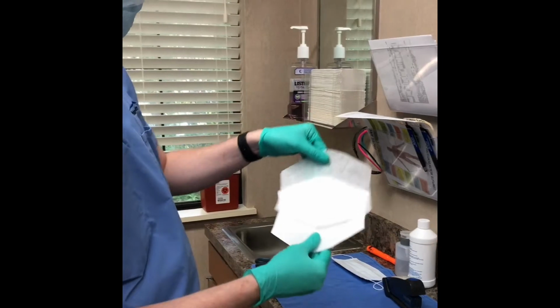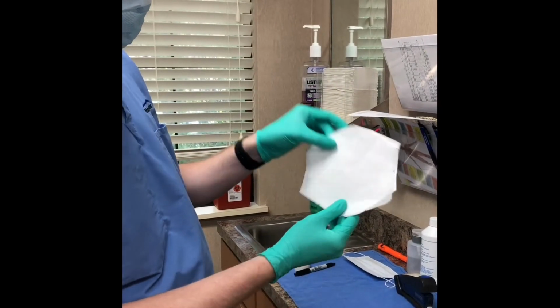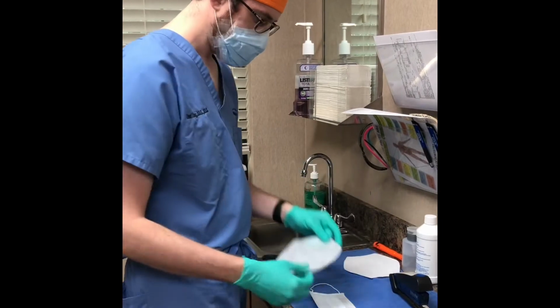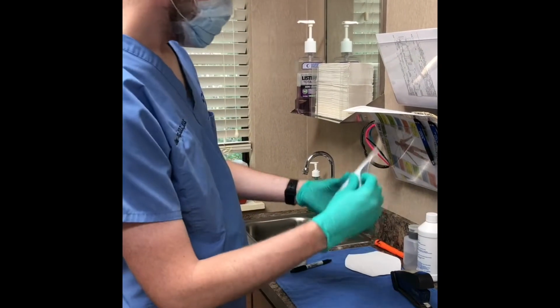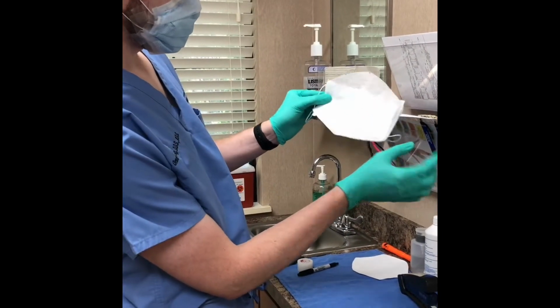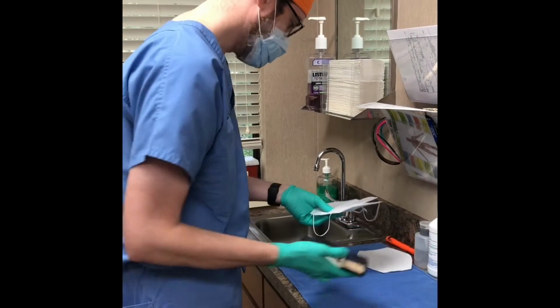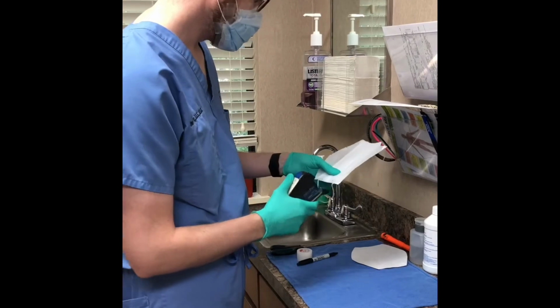So I went through, used the stencil, cut it out. Next thing we're going to do is take a mask and line up the corners. So line it up here and here, and we're going to put a staple. It goes ahead and secures it.